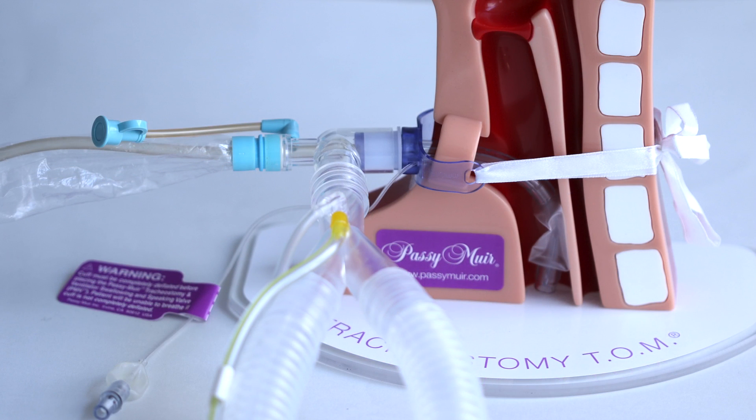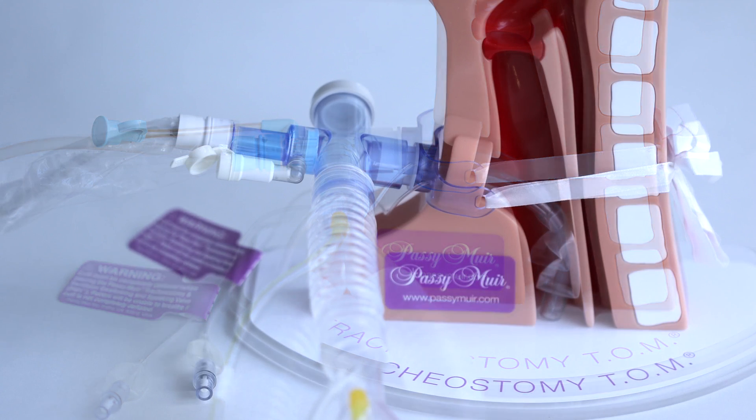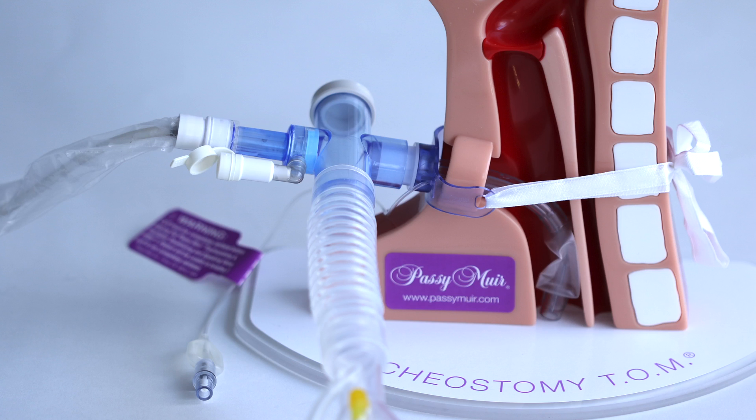The most common ways to connect the PMV into ventilator tubing is by using an elbow-type or T-piece-type inline suction catheter. Passy Muir has manufactured adapters that can be used to connect the most commonly used inline suction catheters to the PMV for ventilator application.